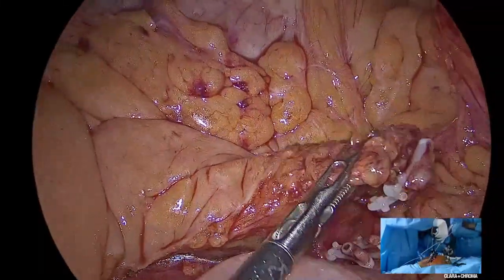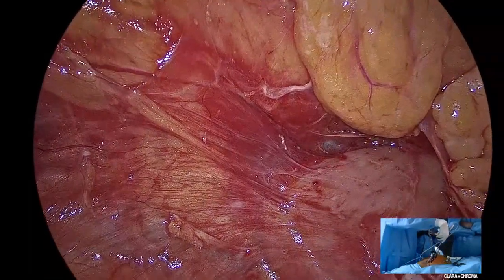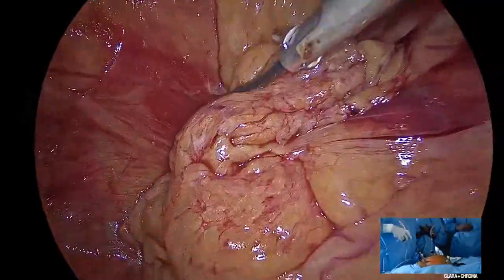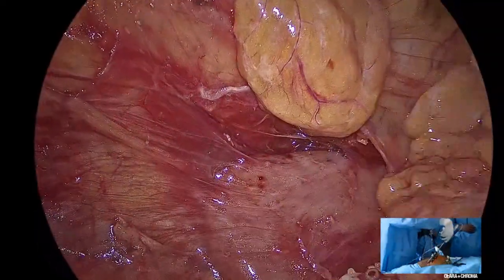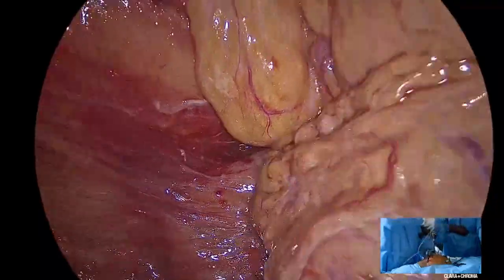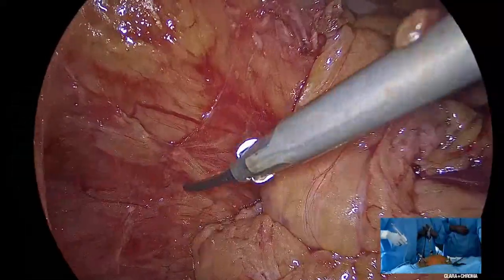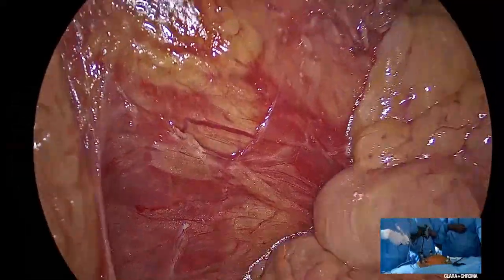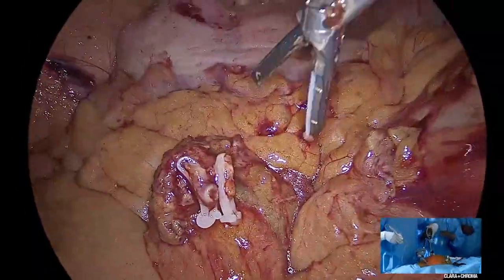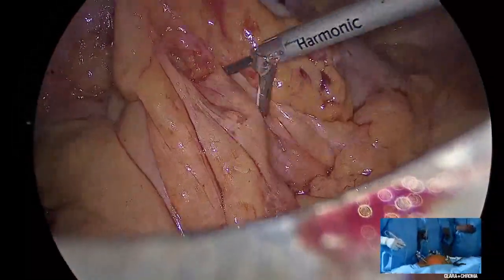Are you able to appreciate this? So this is the ileocolic pedicle, and that's the embryonic plane, and what you see there is the duodenum. Look down. Those are the clips which are almost at the level of the aorta, the SMA. Correct. So that's that. We could do a bit more of dissection here and pat the duodenum further down, but we'll do that later. Let's concentrate on the difficult bit now. While we are there, we'll just finish this up.